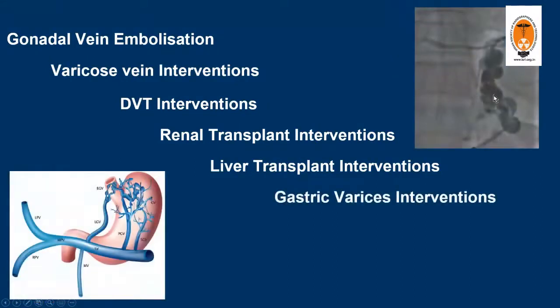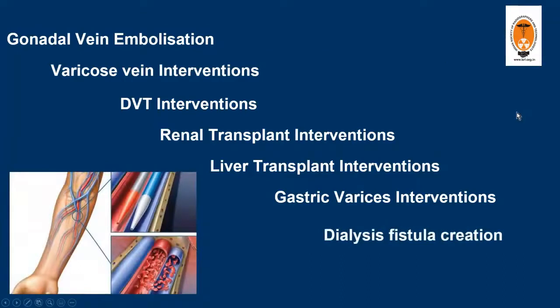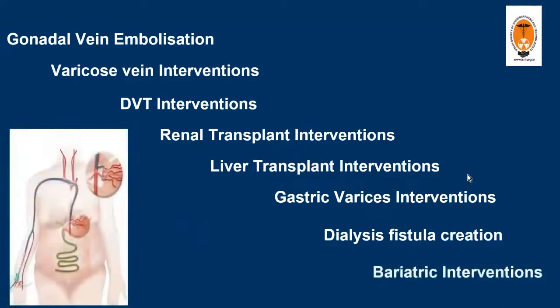We also have treatment now for patients who are having cirrhosis and who are bleeding because of gastric varices. The treatment being called as BRTO, PARTO, or CARTO, depending upon the embolic agent that you are using. Earlier in my talk, I told that we have been able to keep fistulas created by vascular surgeons patent. Now, newer devices have come up wherein we are now able to create fistulas initially, bypassing the role of vascular surgeons as well. We also have now options of left gastric artery embolization in order for weight reduction as part of bariatric embolization as well.